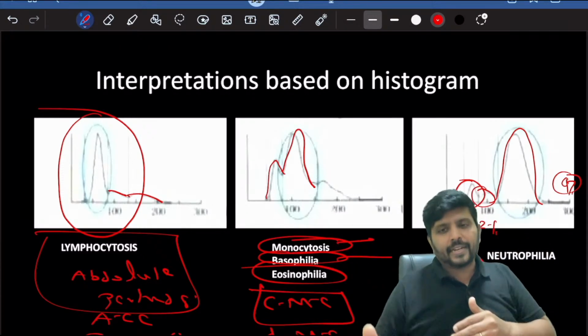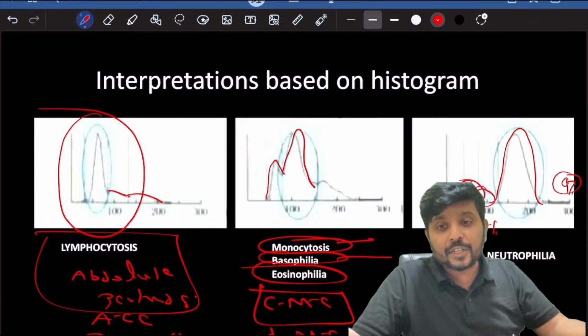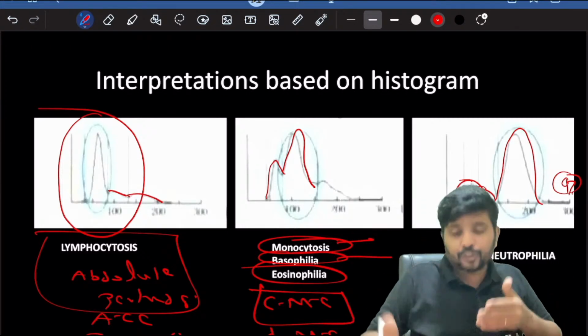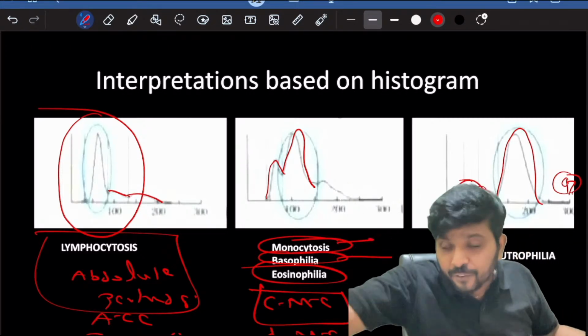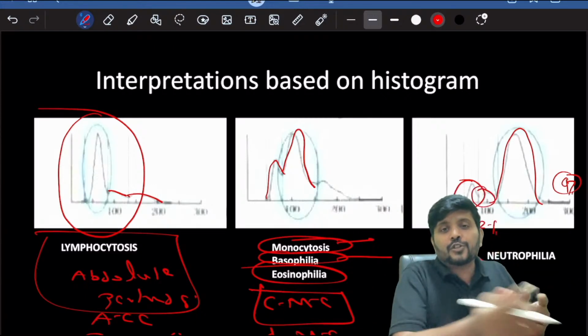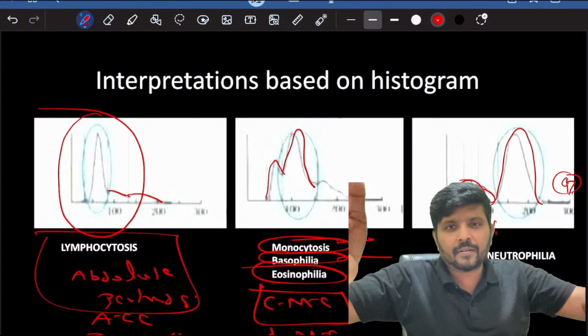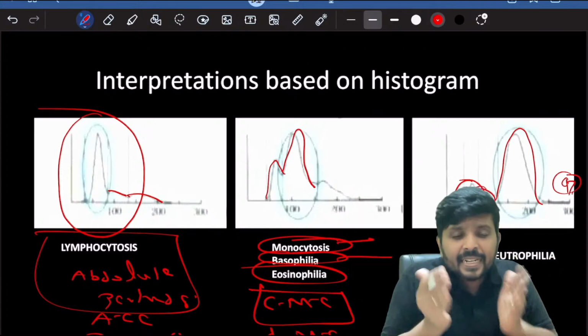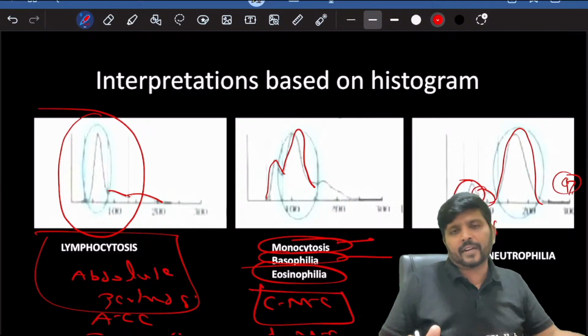Sometimes you will not have a technician, or you will take some time for the blood culture to grow. You need a pathologist to come and see whether it is a malignancy or not. But before their arrival, just based on one drop of blood, you can plan your management. That is the importance of the point of care test by your automated hemogram.